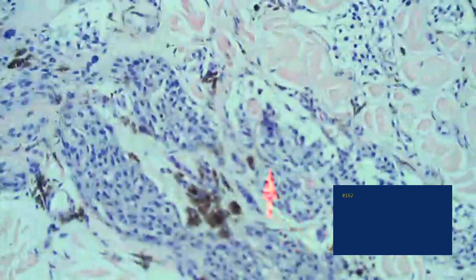Right here. So this is a type of combined blue nevus. It's got multiple different patterns. It's got features of blue nevus. It's got features of banal nevus at the top. It's got some of these deep extending nests of cells. So there are a bunch of different subtypes of blue nevus, and one type is a so-called deep penetrating nevus, which is consistent with that variant. It's not perfect for it, but it's consistent with it. So that's more of a histologic curiosity.